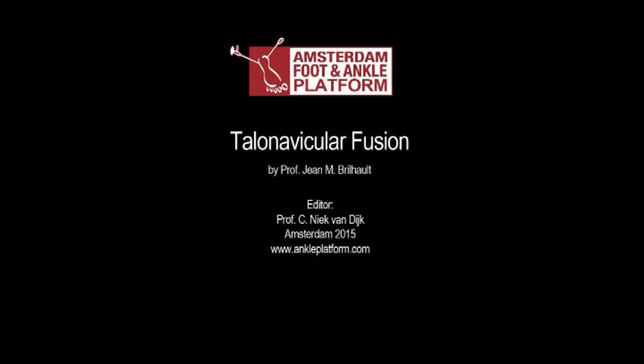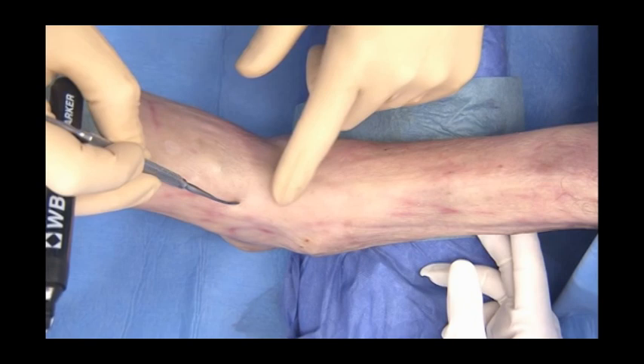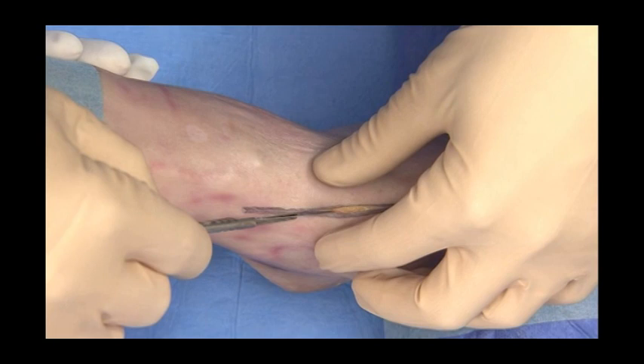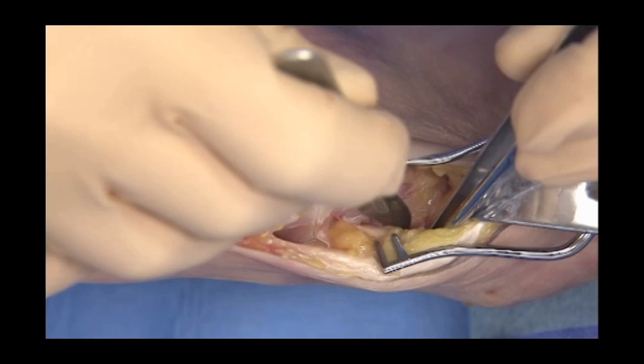A talonavicular fusion is illustrated here through an anteromedial approach in order to facilitate addressing any ankle pathology. The incision is centred on the anterior tibial tendon with careful dissection of the extensor retinaculum. The approach to the joint is performed either medially or laterally to the tendon depending on the foot pre-op deformity.